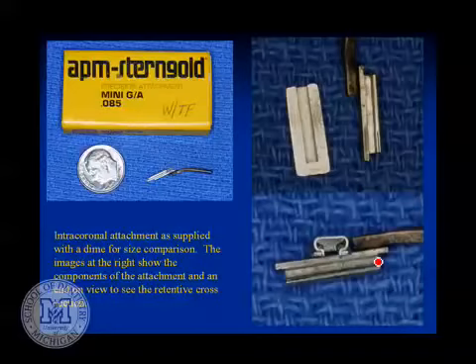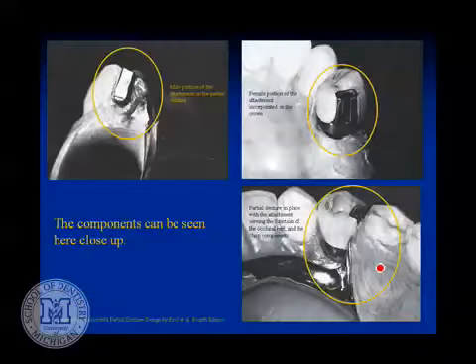So here's the two halves, and the part that would go in the tooth, you can see its shape. And then the shape of this part that goes onto the partial denture obviously interfaces in here. These things fit very snugly, and they do take some fitting when you're doing them. So here's the part that's in the partial denture, the male half, and here's the female half.